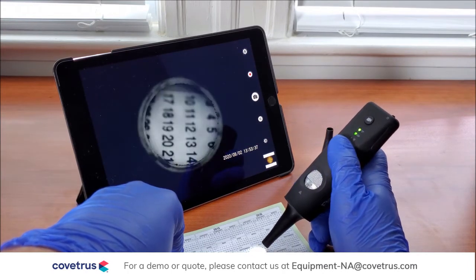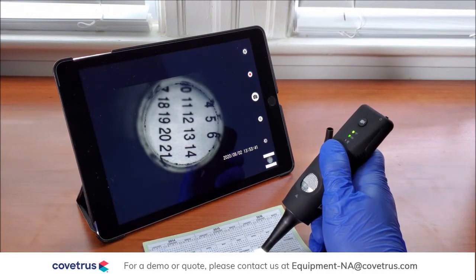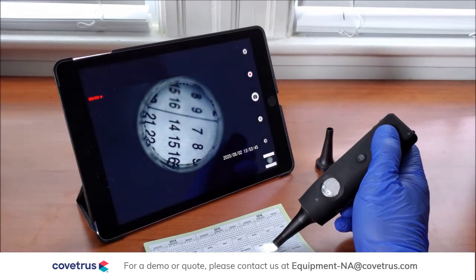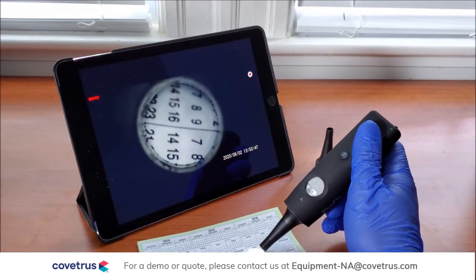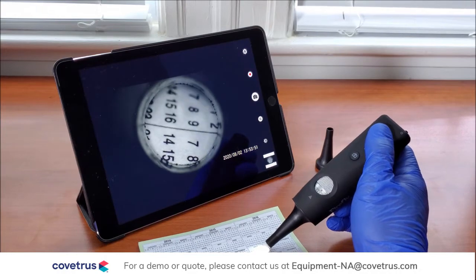If I want to take a picture, I have a snapshot button here. I can also record video — if I press it once, the recording starts, and if I press it again, the recording stops.